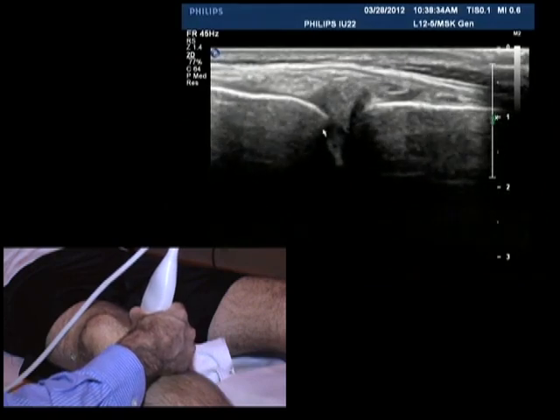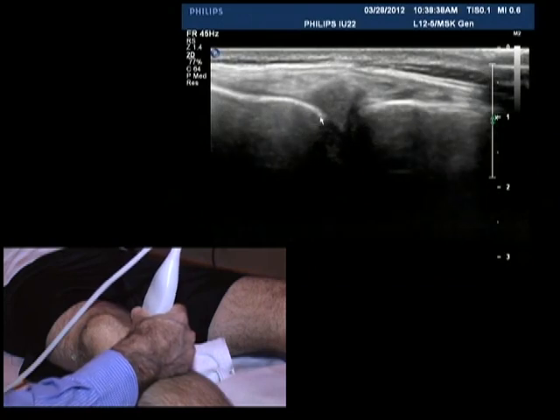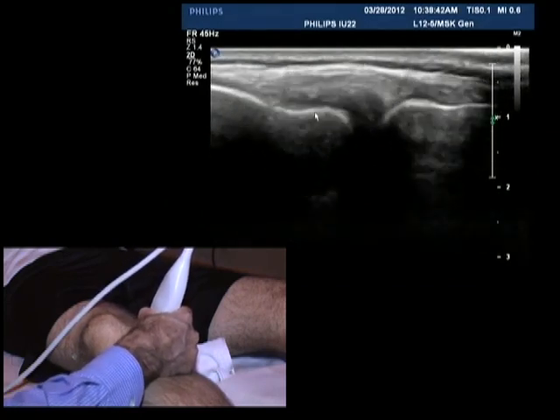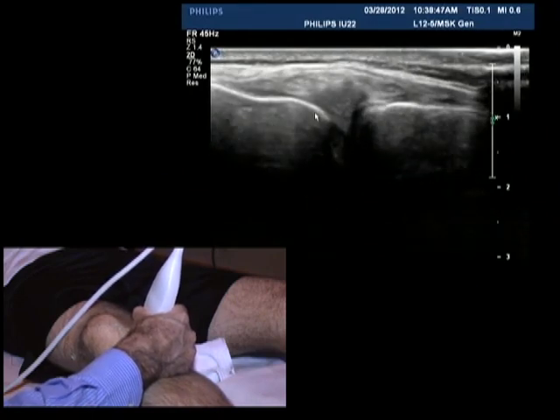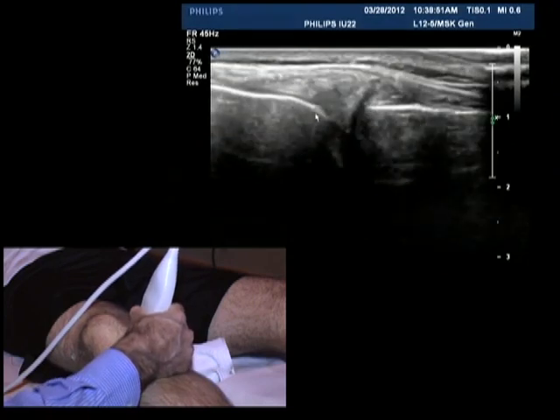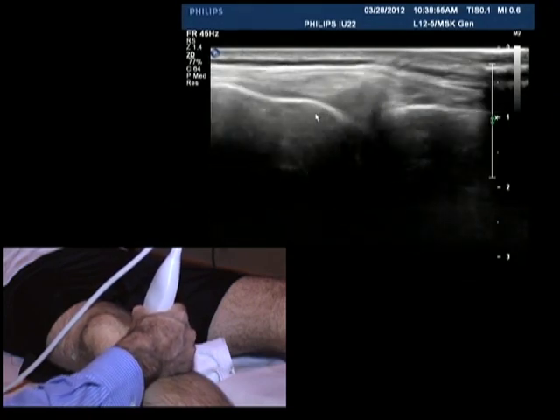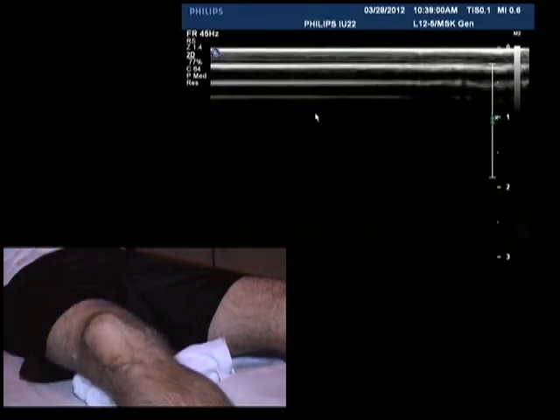See, and actually, look, you can see the body of the medial meniscus here. Now, we do see the menisci when we're examining on ultrasound, but I wouldn't recommend you use it as a tool for diagnosing meniscal tears. Occasionally you'll see an obvious meniscal tear, incidentally, on ultrasound, but really evaluation of the menisci is best left to MR. Let's try that. Can we try that? See if we can cone down, or see if we can get a better definition of those two layers of the MCL.